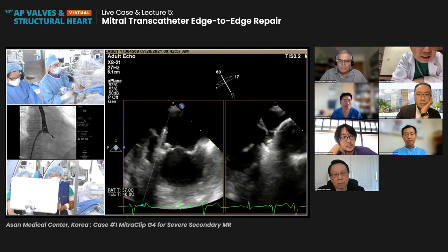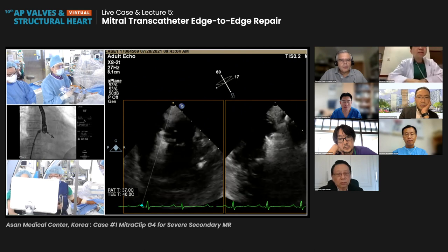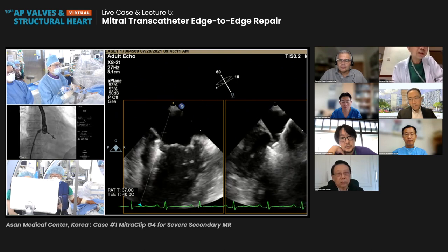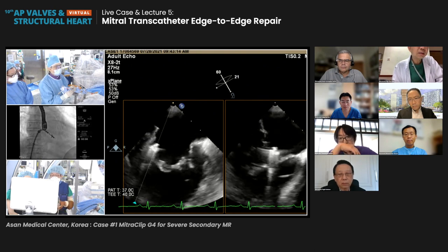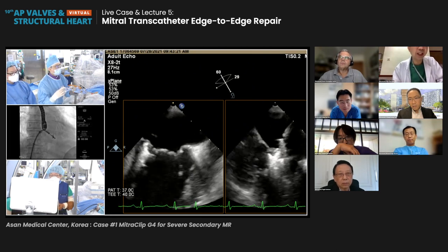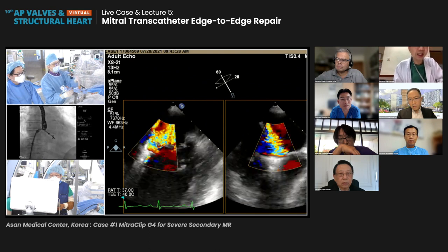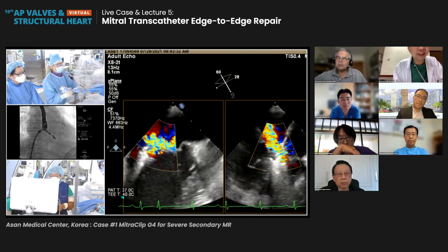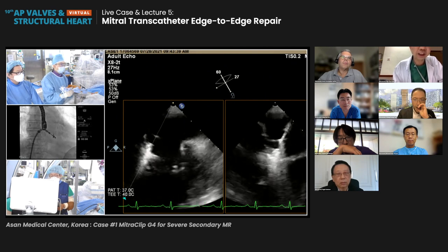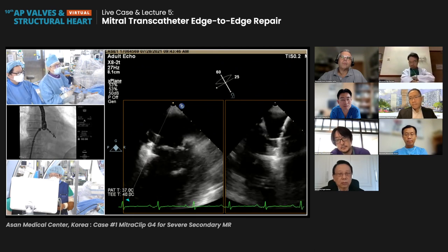when the visualization of the leaflet is very difficult? The echo image is not good in this patient. Usually, the medial commissural region is easier for echo compared with the lateral region. Okay, now it can be seen. Actually, we've tried a few, but only in very few cases did we find the TEE extremely difficult to analyze, and we actually put in intracardiac echo. Move the clip a little bit medially compared with the initial position, toward a central position. Only very few cases. The MR was a bit less before. How is this? Okay, this is the best.